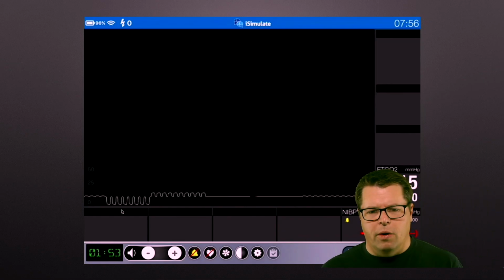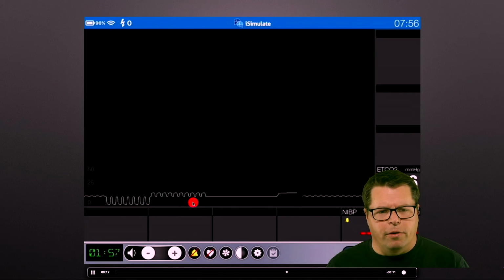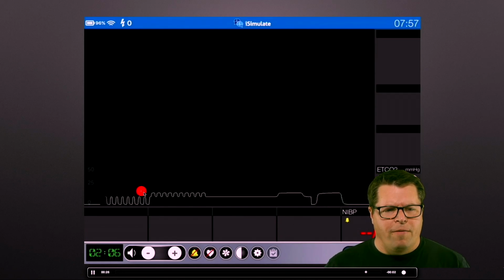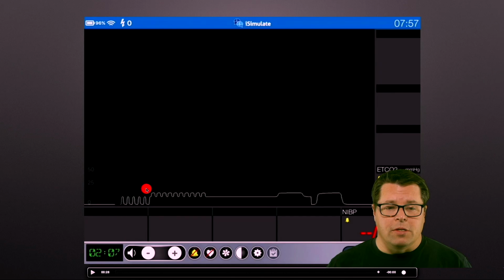So pretty low. And then I look at that tracing and I think, well, based on the criteria that we've looked at before, that doesn't really look like a breath the way we think of it, like this guy does. What's going on here? If I were to put time on this, these are going at about 110, 120 breaths a minute for these little shallow things. What's happening here? This was when the tube is stuck in the pharynx and air is being blown past it with each chest compression. You notice we're not getting an actual waveform.